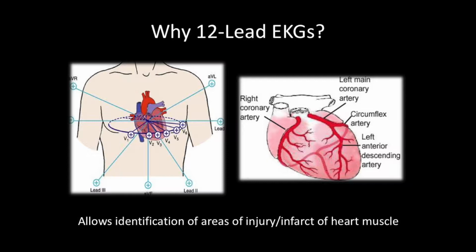It's a little bit like pulse ox. If somebody tells you they have shortness of breath, and their pulse ox is 93 or 94, you're still going to give them oxygen, not because the pulse ox says they're 94, right? Similar with the 12 lead, if the 12 lead ends up saying it's nothing, you're still going to treat it as if it was something, okay?